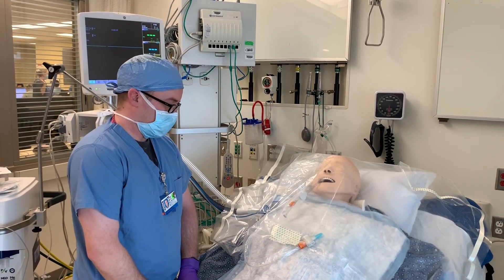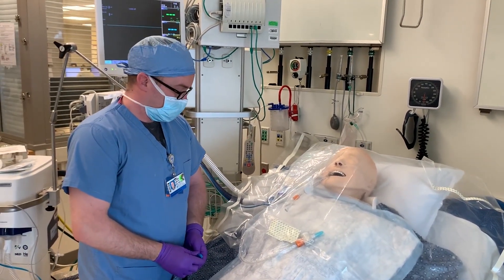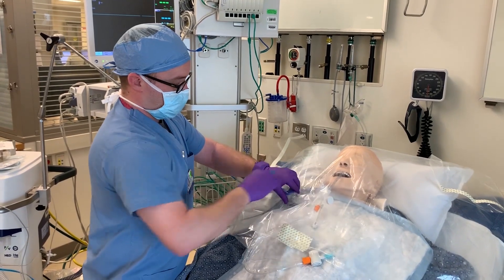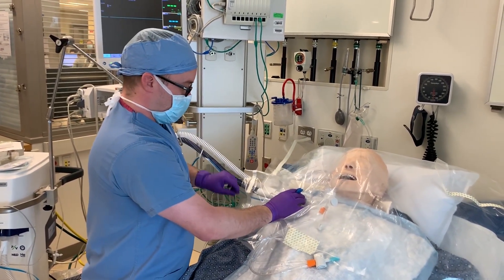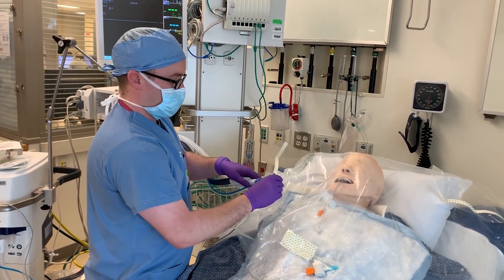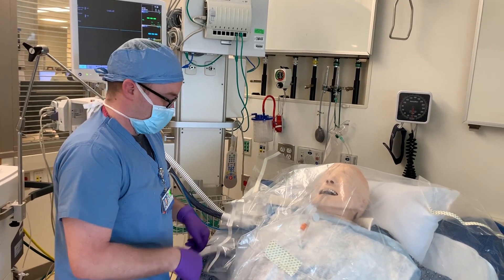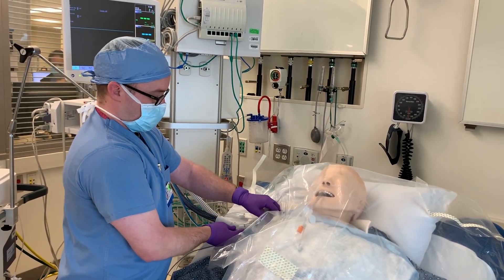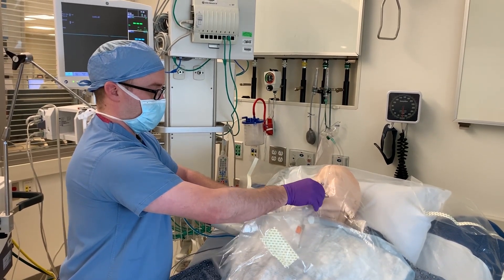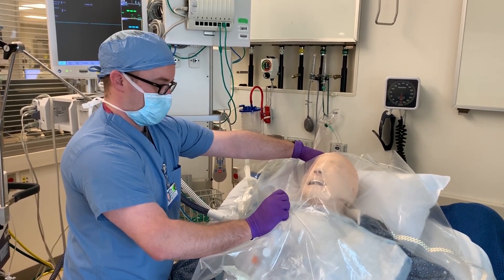When ready for extubation, you will turn the vent to standby. First, disconnect the circuit behind the capnography line, between the capnography line and the corrugated tubing. Once disconnected, pull the circuit away and quickly cap it once any secretions have been caught on the chuck. Next, deflate the cuff with the syringe, trying to keep it away from the patient's face as much as possible. Then once ready, extubate the patient and pull the endotracheal tube. Keep the drape over the patient's face. It's okay if the endotracheal tube and corrugation are over the chuck, as this should catch any secretions.